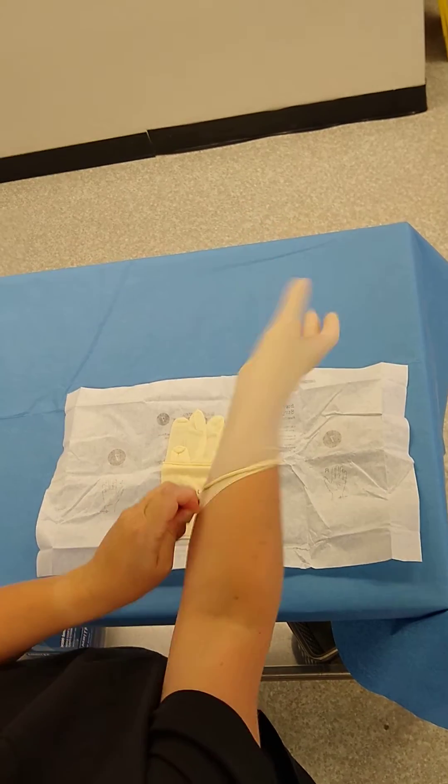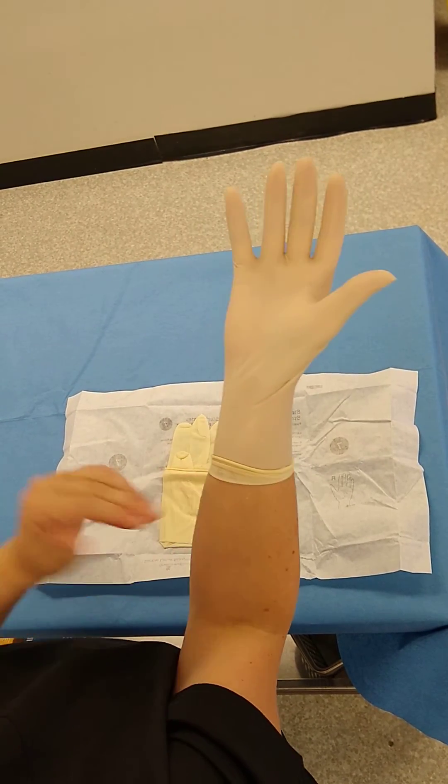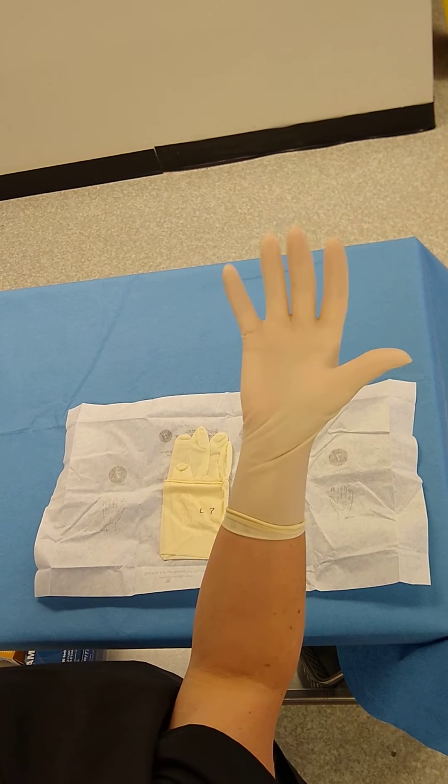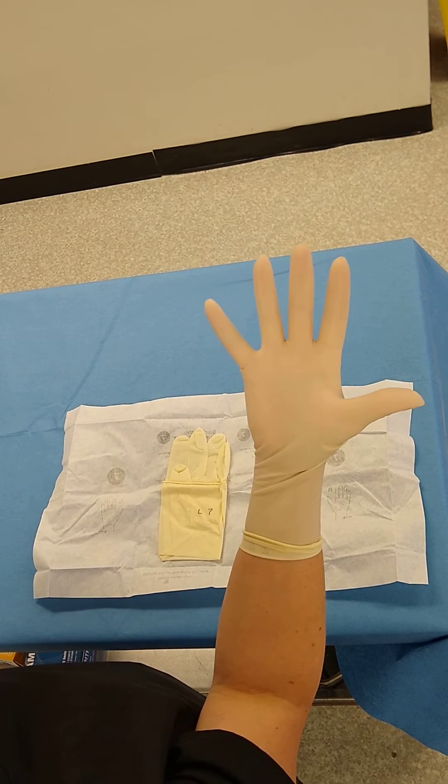If you want to wrench it down a little bit further like this, you can, but don't ever stick your hand in there to pull it over or you'll contaminate your glove. One hand in.